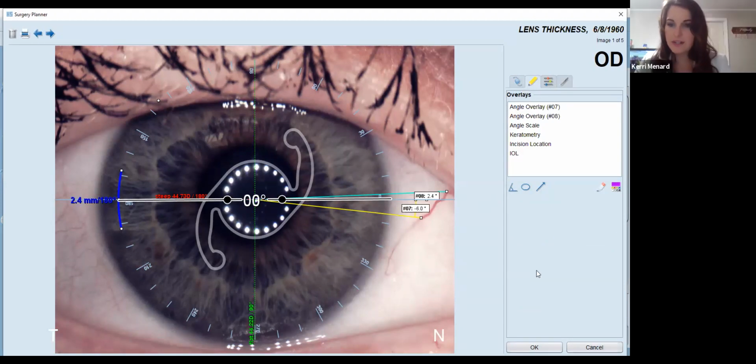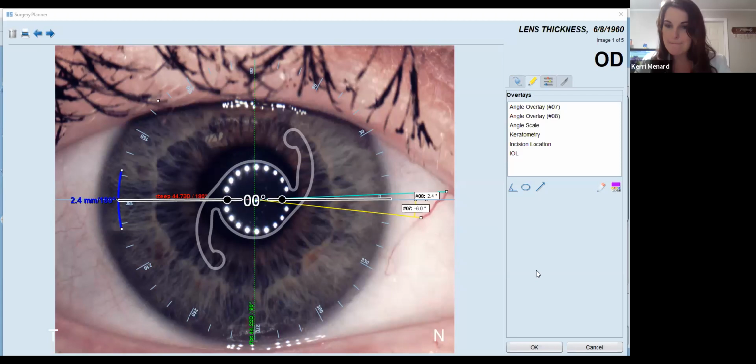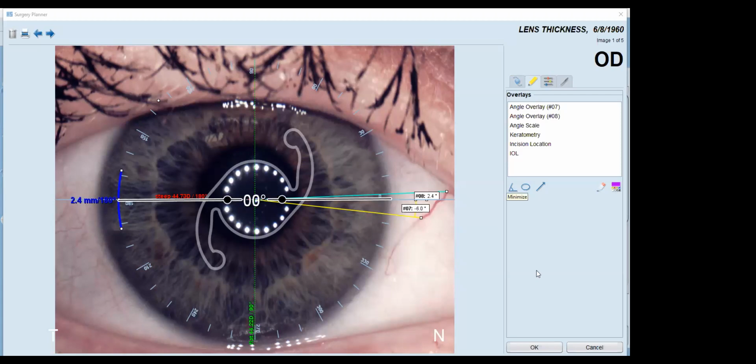Perfect. I know we did have a question early on about moving our gates and if it has to be with multiple colors or if it could be a single spike. And I did emphasize the point of multiple colors. I don't know if you want to show that again. Yeah, so multiple colors is recommended, but a bilateral comparison is telling too. So that's a nice way to validate those interesting spikes and if they're weak or if they're only one single color.